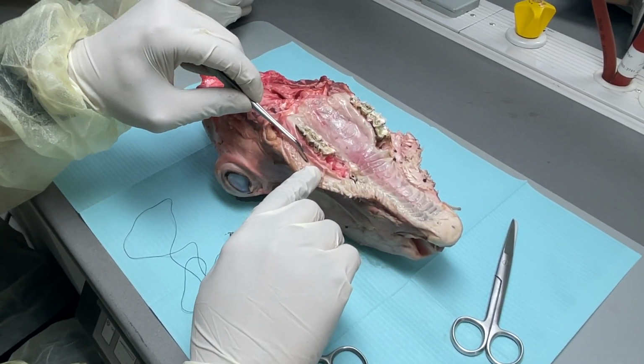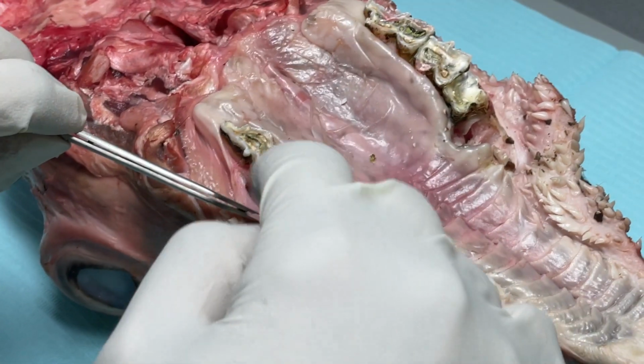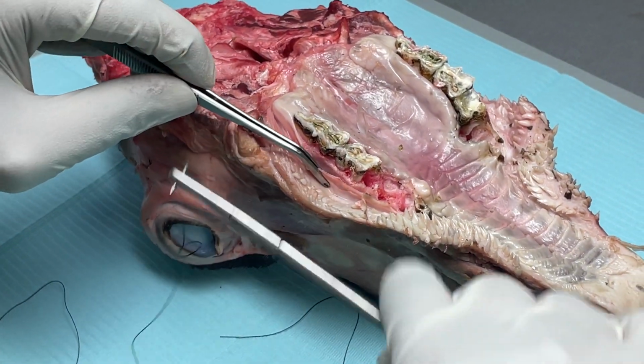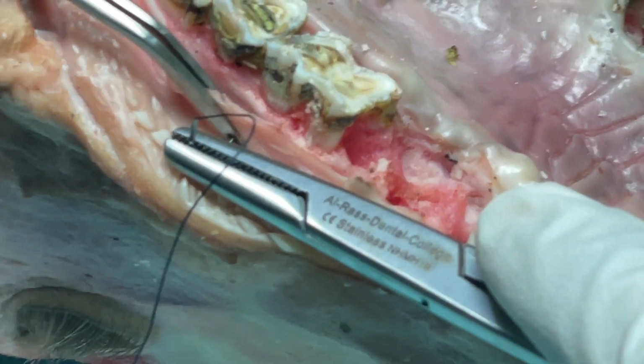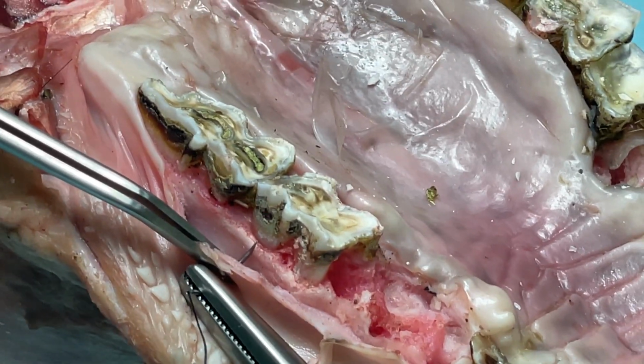See? So I just have to pass through here. Easily it will come out through the other one. This eye will guide me. Now I am going to pass it from here, through the other. On the same side I have taken it.